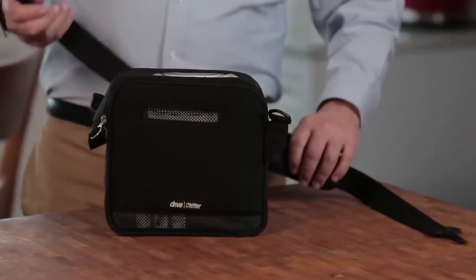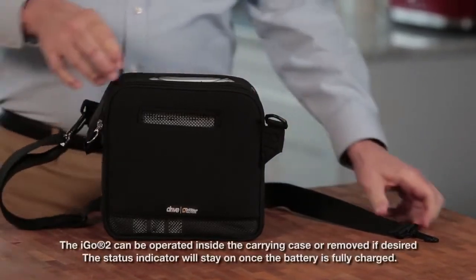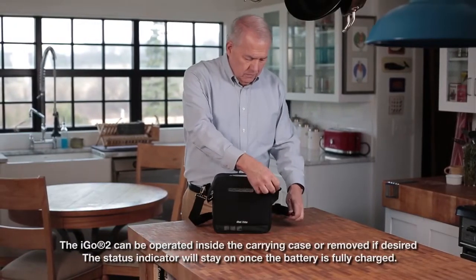Attach the shoulder strap to the carrying case by clipping it to the D-rings on each side. The iGo 2 is now ready to use.